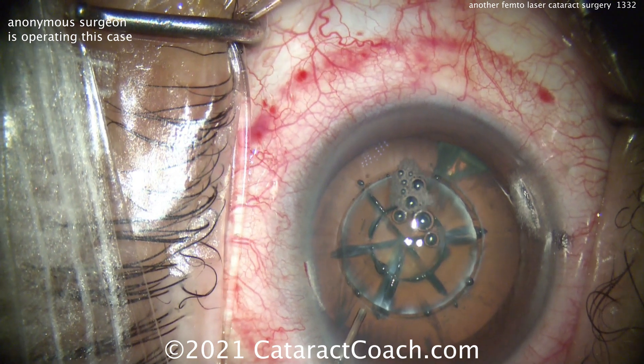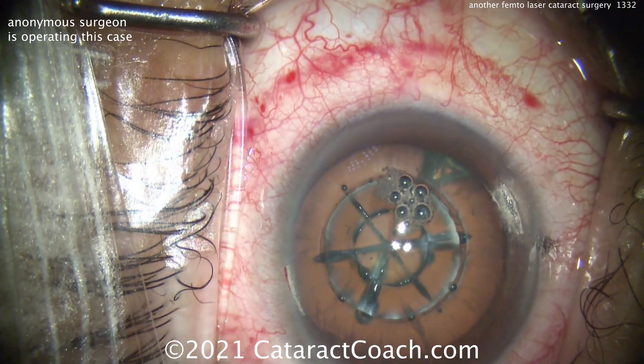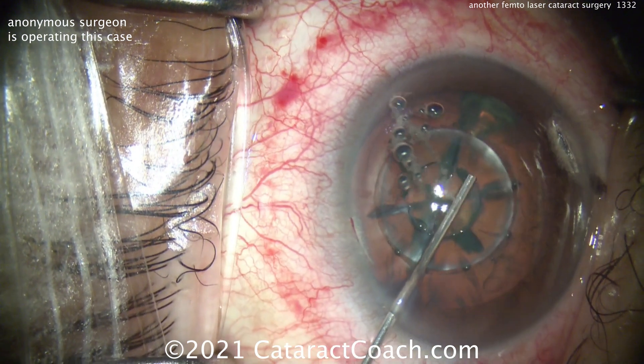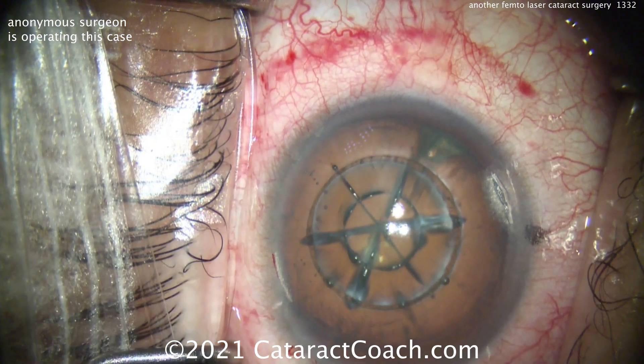So now, it looks like putting in some perhaps lidocaine inside the anterior chamber for added anesthesia. And that subconjunctival hemorrhage there — you see the red ring. Of course, that'll go away. That's not going to stay permanently; that'll be gone within a couple of days. There's the viscoelastic going inside to inflate the eye.